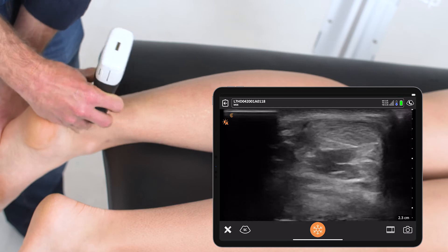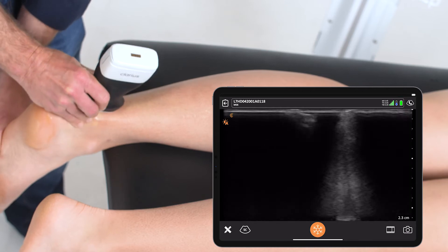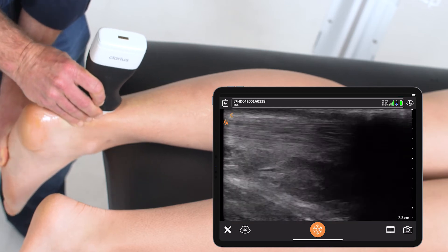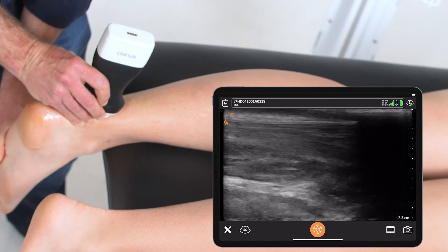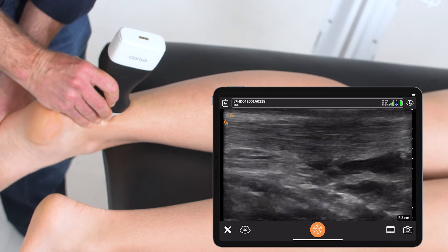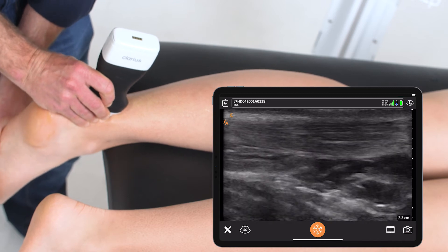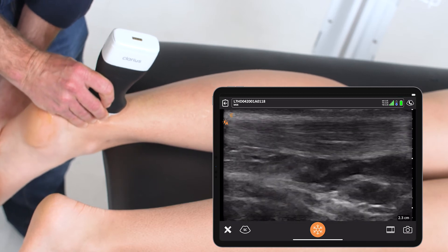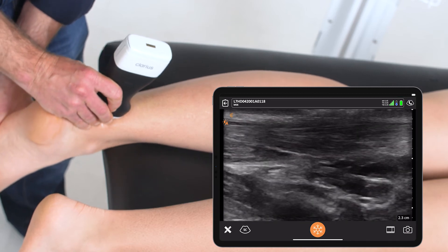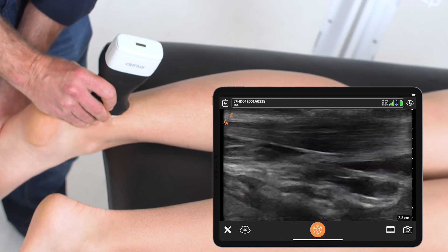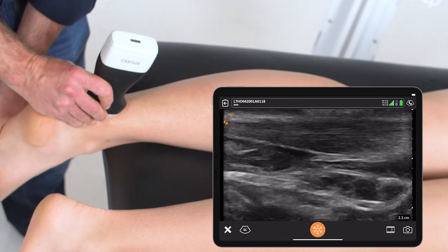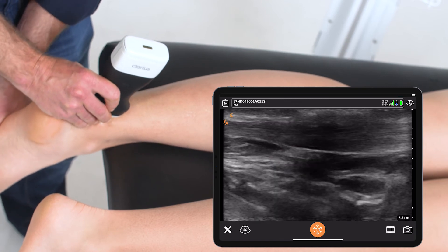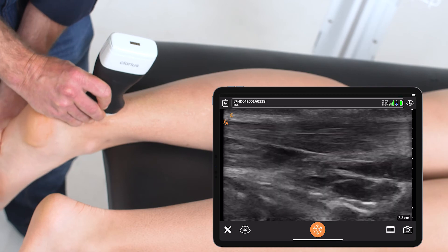The tendon can also be visualized going through its dynamic range of motion by dorsiflexing and plantarflexing the foot, with the probe on the tendon itself — both to visualize the fat underneath the Achilles and to see it thickening and lengthening out through its range of motion.